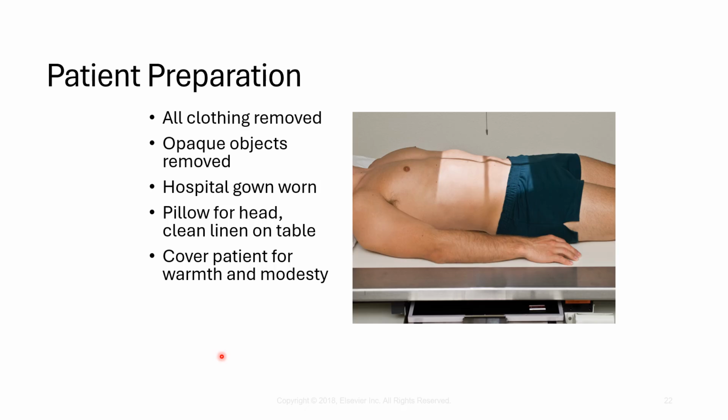I would never let the patient walk barefoot, probably not even in socks, just because you never know what can be on the floor in a hospital or imaging center. It's just a good idea to have their feet covered. Any opaque objects would have to be removed. Any piercings, buttons, zippers, clips, anything that the patient might have that is able to be removed that would be opaque should be removed. And we typically put a gown on with the opening to the back.